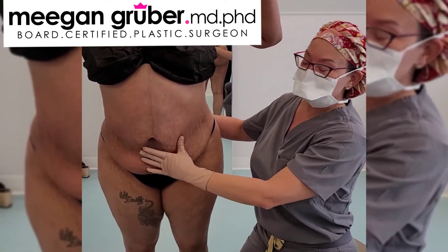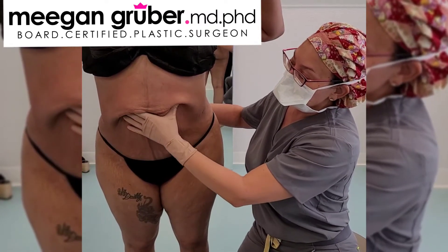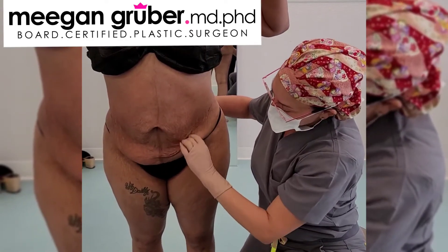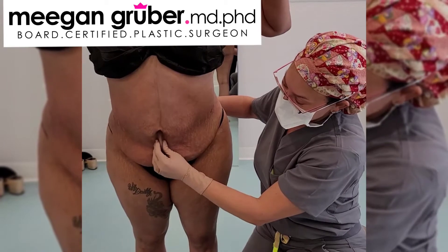We have finished the liposuction, so you can see that the skin is mobile. How did the lipo feel? It was fine. Okay, and now we've got just this extra skin here and a little bit of extra skin here to get rid of.